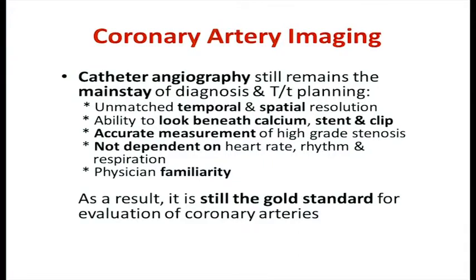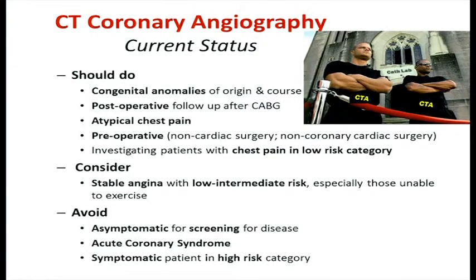So it is still the gold standard, but at the moment it is advisable to do a CT coronary angiography if you are suspecting a patient to have congenital anomalies of origin and course, if the patient has had a CABG and has come for a follow-up, if the patient has got an atypical chest pain and you think there is a low probability of having coronary artery disease, for a preoperative patient, and also if there is a chest pain in low risk category.